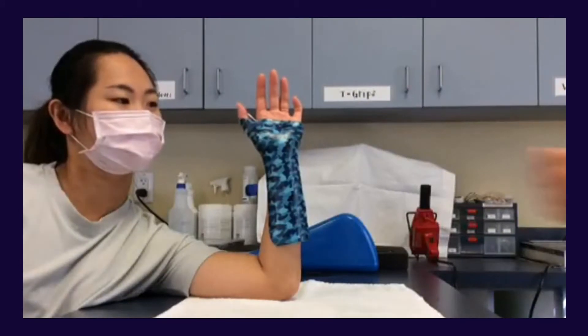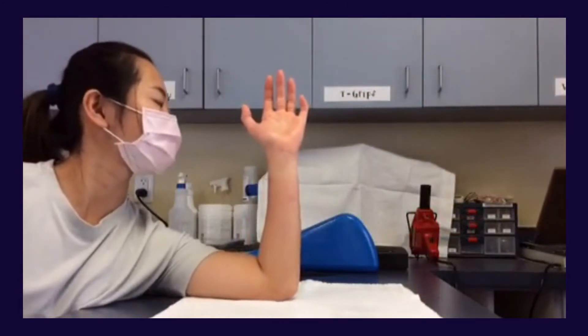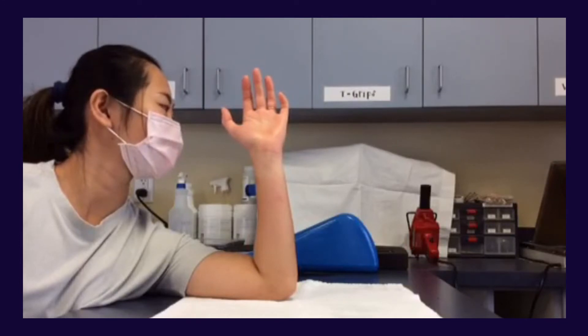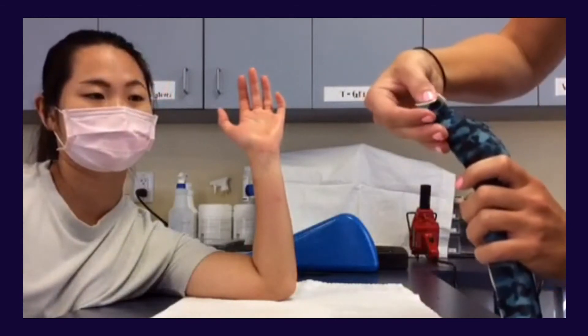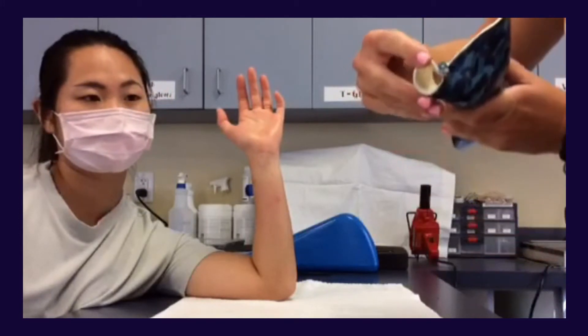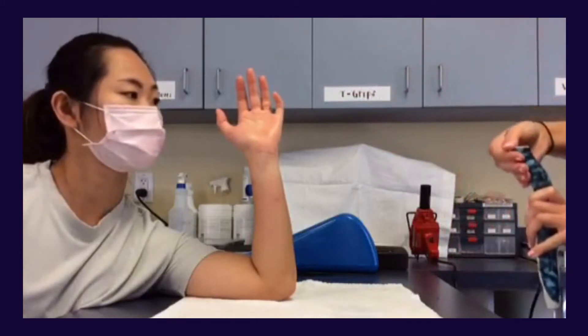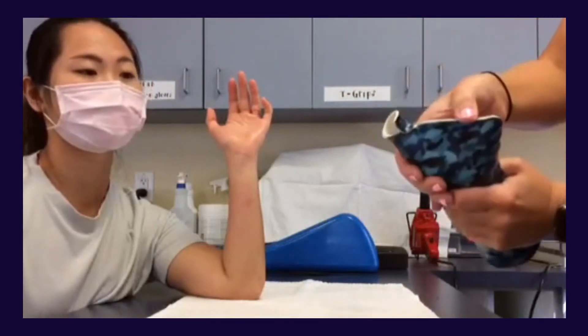Now that your orthosis has molded to the patient's hand and forearm how you would like, start to make your smaller adjustments. You can either use your heat gun or dip the orthosis back into the splint pan for this. Rounding the top portion of the thumb where the IP is free to move is one tip for extra comfort for the patient — you want the patient moving his or her IP while in this orthosis. You can also round the top portion where the DPC is cleared in order to ensure comfort for the other digits.